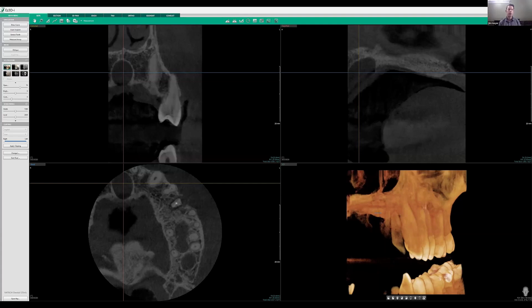So let's go ahead and, Dr. Bukhari, we're going to talk a little bit about analysis of the findings, talking about the borders, well-defined, ill-defined, and moving into that. So let's go ahead and do that now.